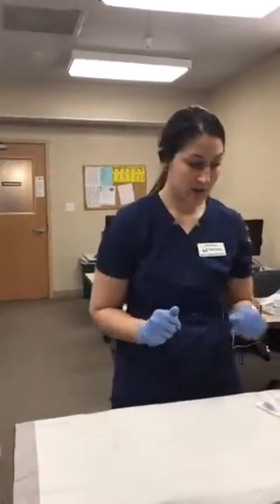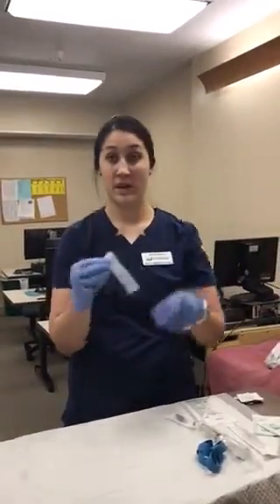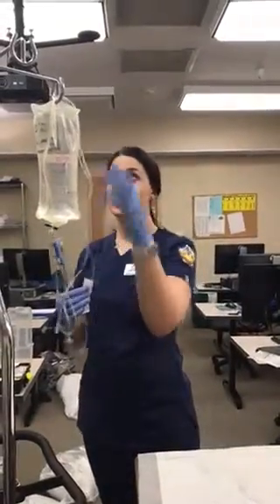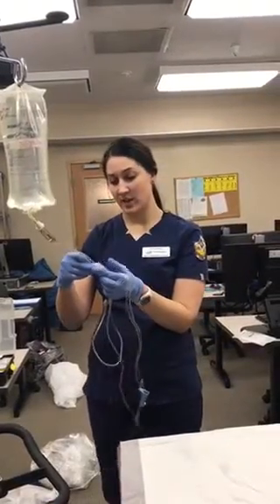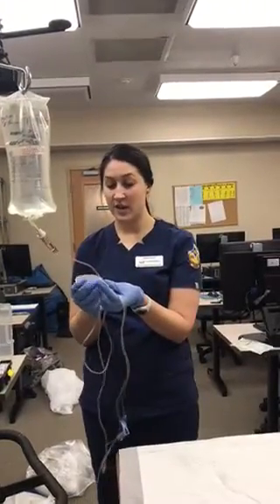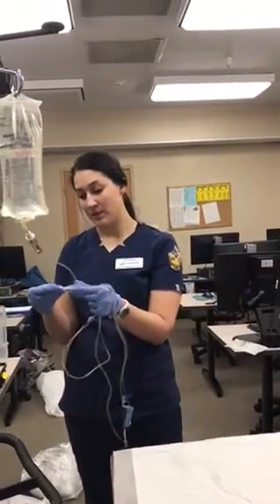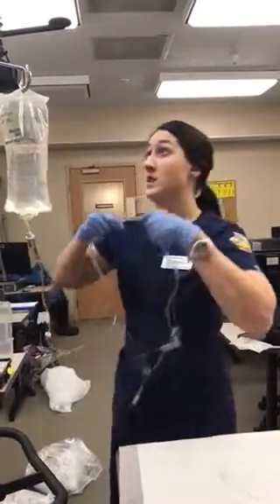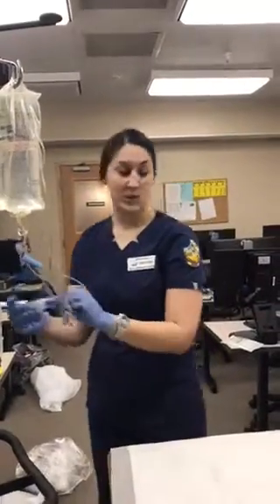The next thing I'm going to do is prepare the rest of my supplies. I do actually need to label my IV tubing because some medications require different times for the tubing to be changed. So we just want to make sure that is on there so that if somebody does come in, the start time for the infusion is there, and the date we administer it. I also put Bob's name and date of birth on there just so that if anything does happen, we know where it came from. And if you do see something like that and it's not in the right patient's room, you should just throw it away and start new. But that just kind of protects us.